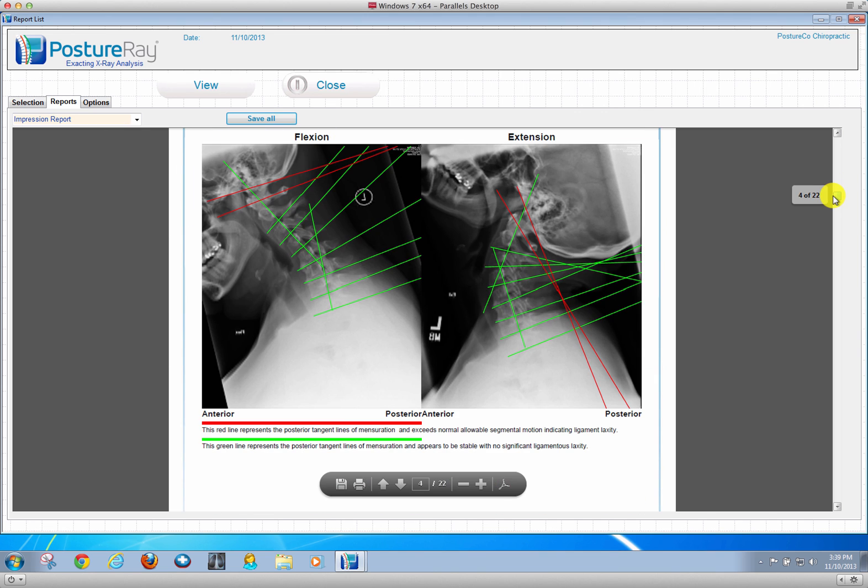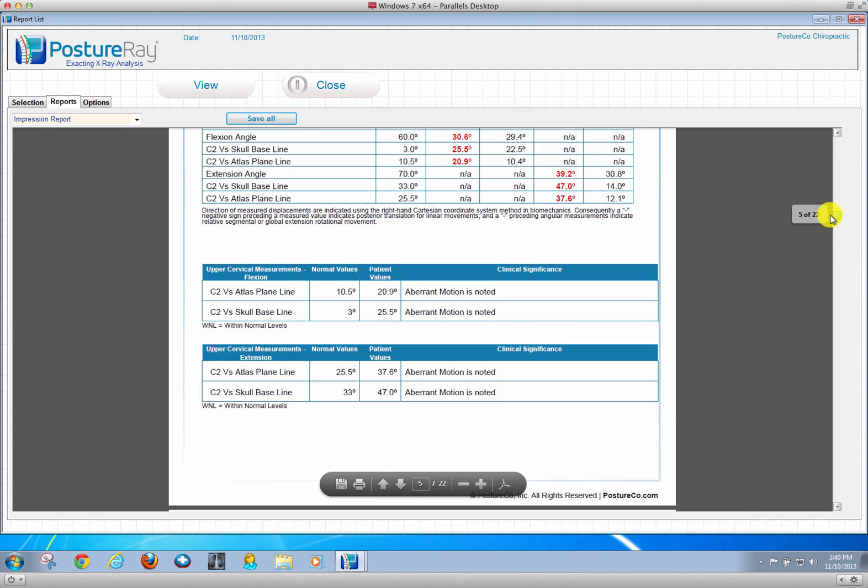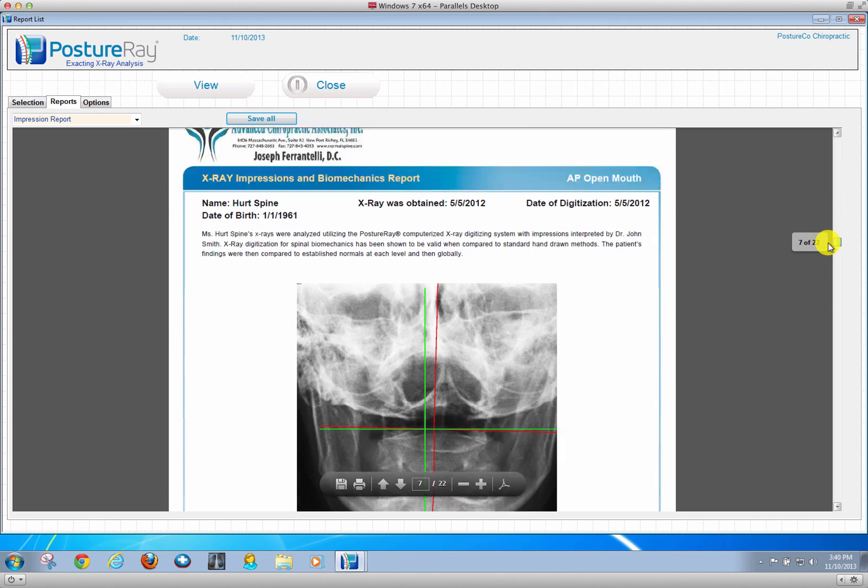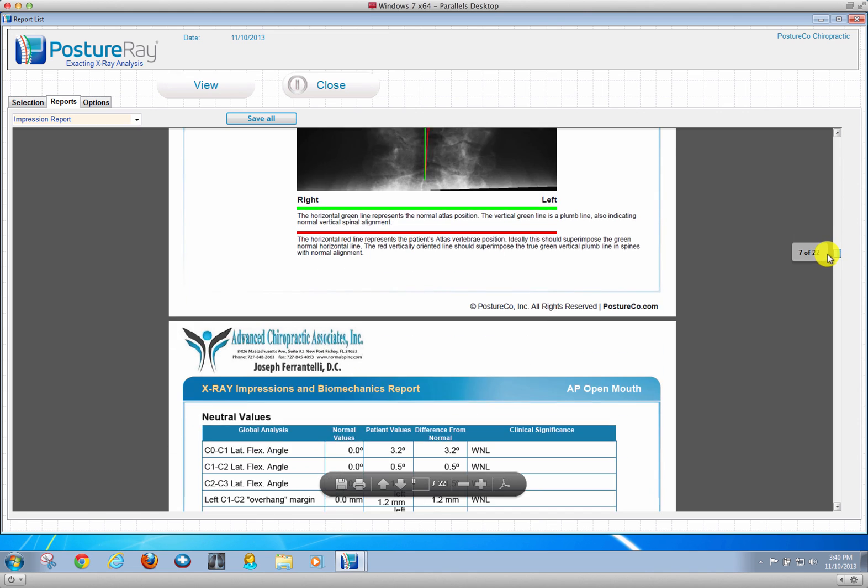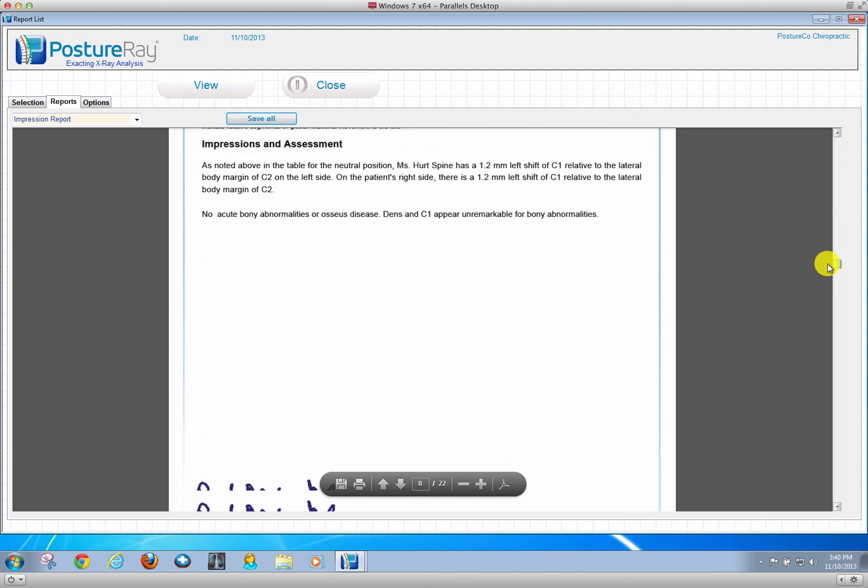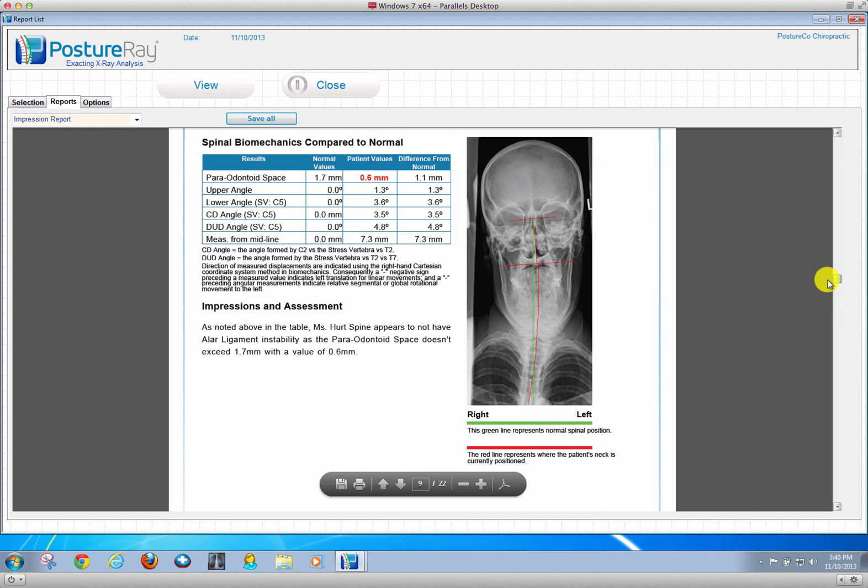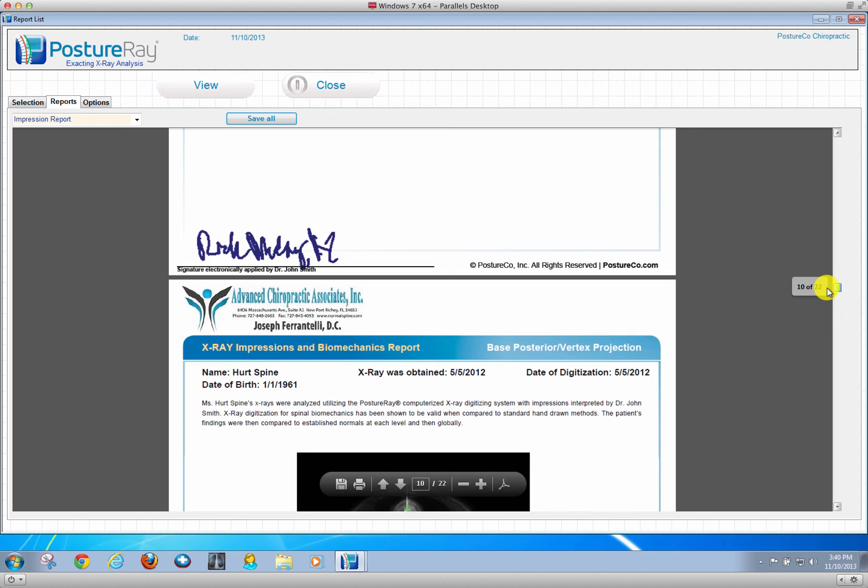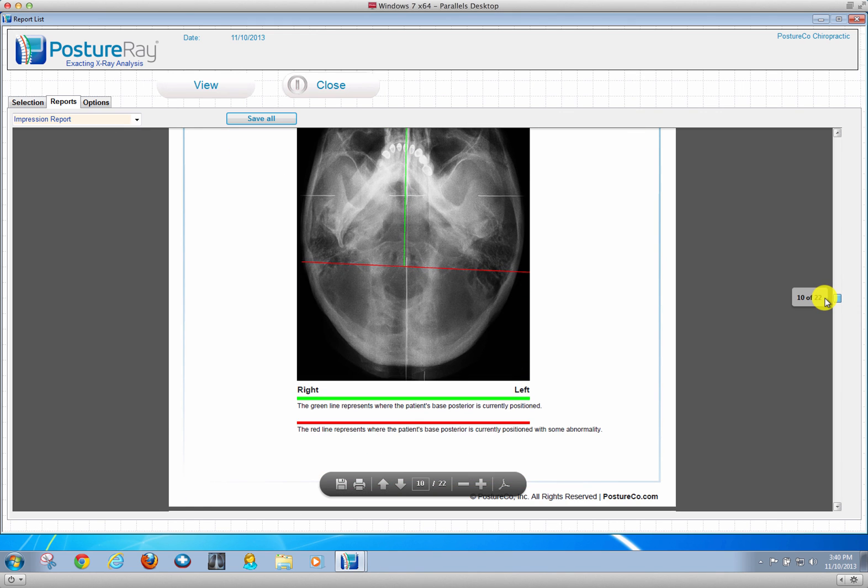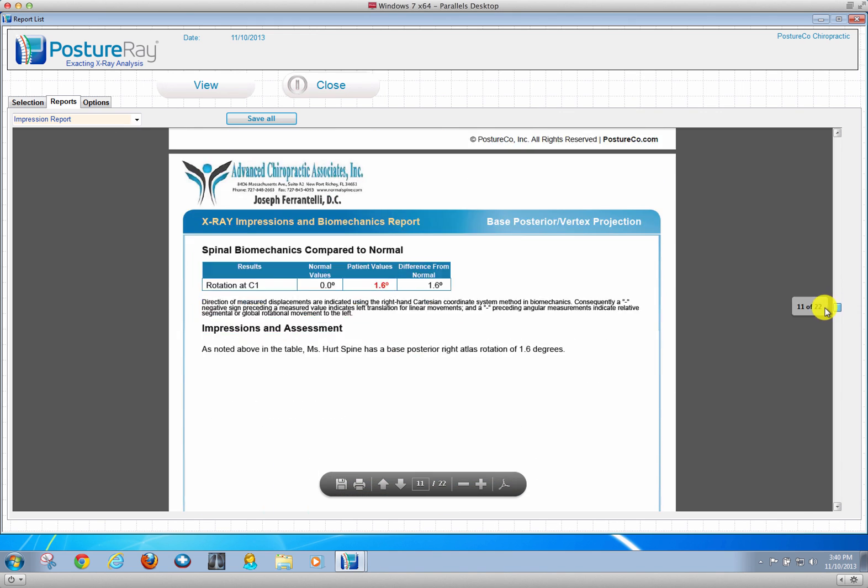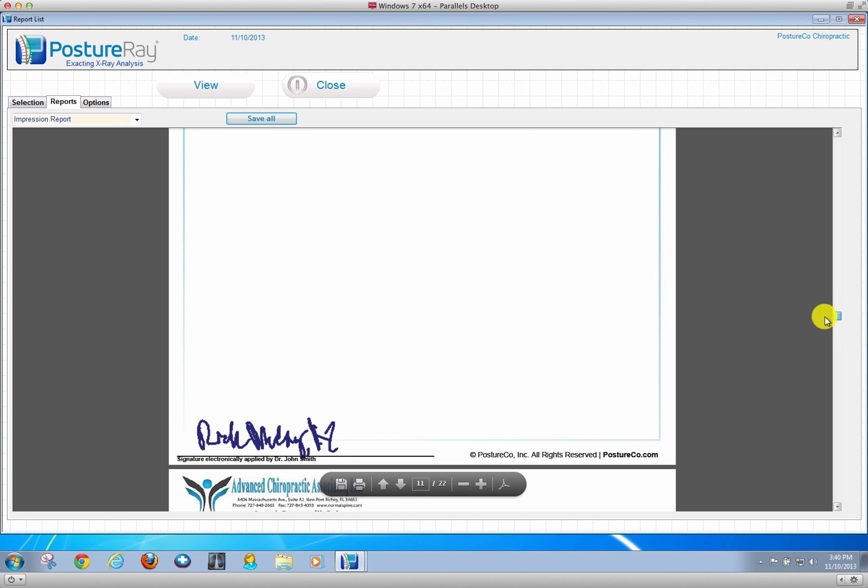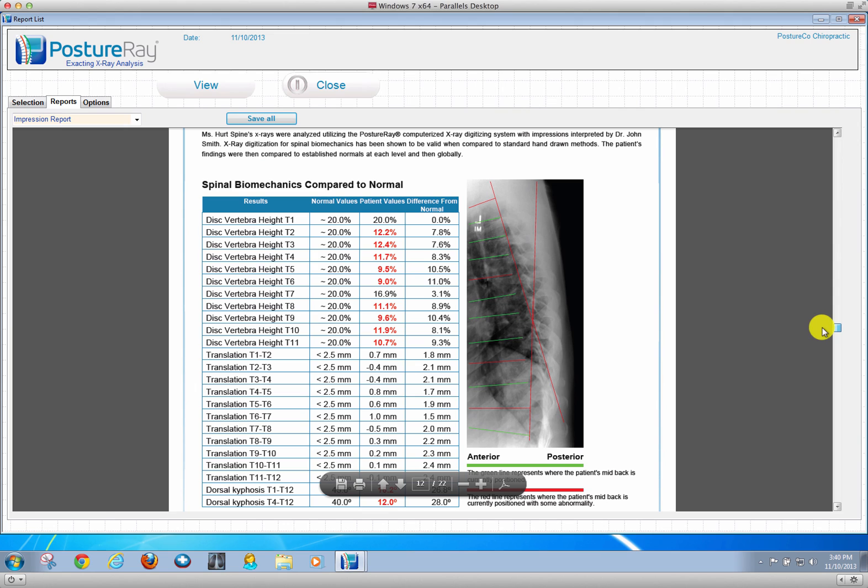Flexion extension analysis as well. And as simple as that, going through every x-ray view. So the Clear technique analysis is now available. For more information, please browse to x-rayanalysis.com or postureanalysis.com. You may email us at info at postureco.com. Thank you.